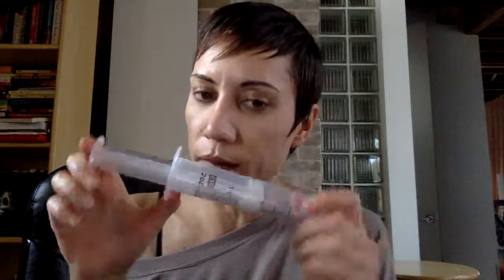And I have created my own silicone tip that goes in the pusher inside of this barrel, and the barrel is polycarbonate, so this one would be 100% ozone resistant. Again, this is all in theory. We'll see how it works in practice.